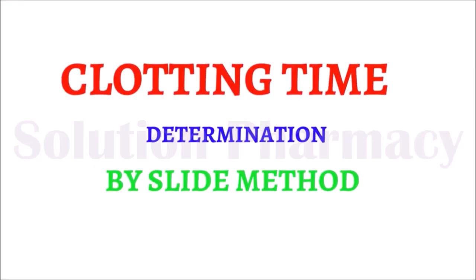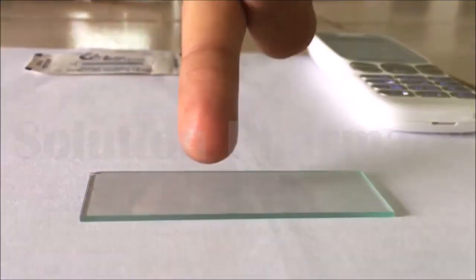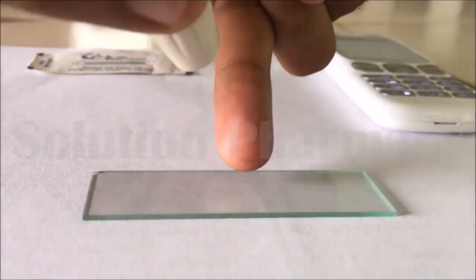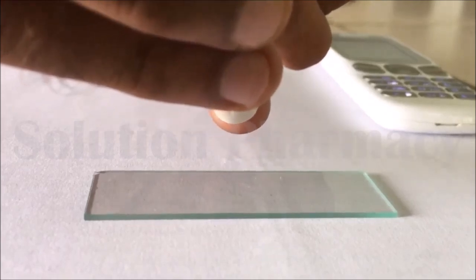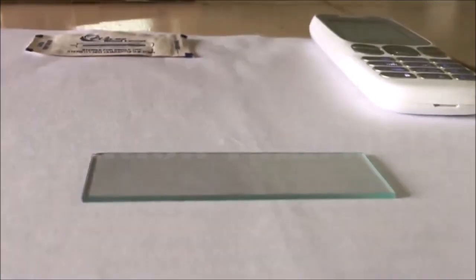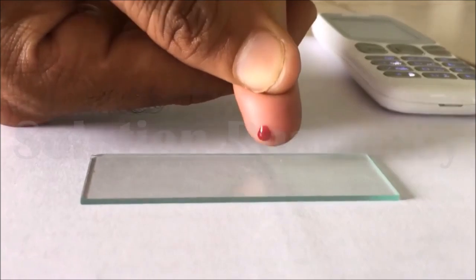Next, determination of clotting time of the blood by the slide method. For determining clotting time by the slide method, first sterilize your fingertip with ethanol, usually 70% ethanol, with the help of a cotton swab. You can also use another suitable antiseptic to sterilize your finger. After sterilizing the fingertip, prick it with the help of a pricker pen which has a lancet inside it. After pricking, we will obtain free flowing blood.